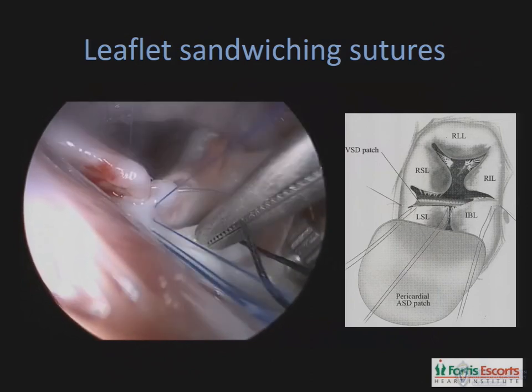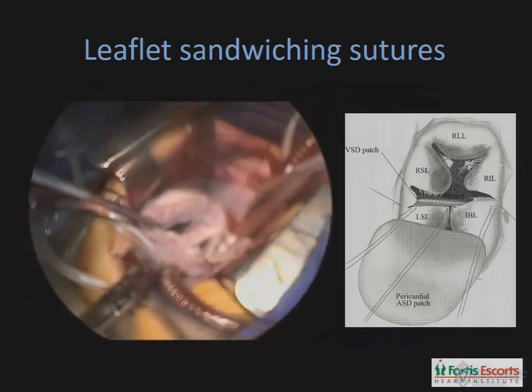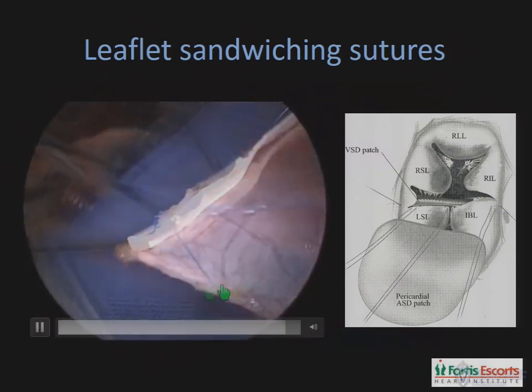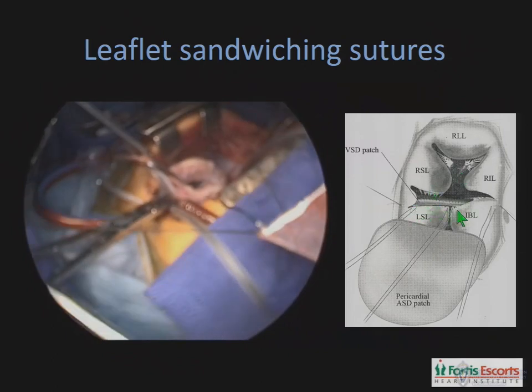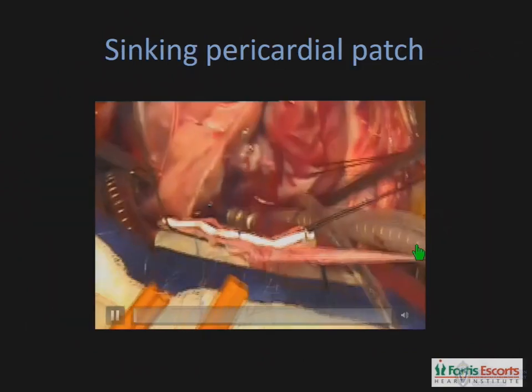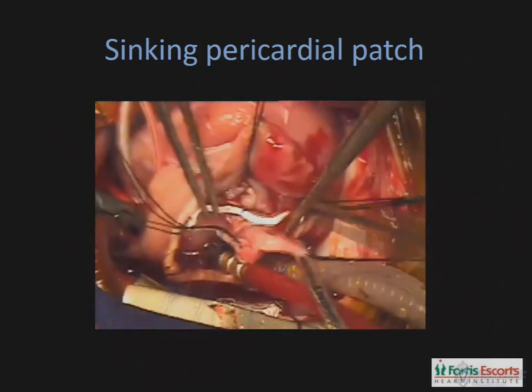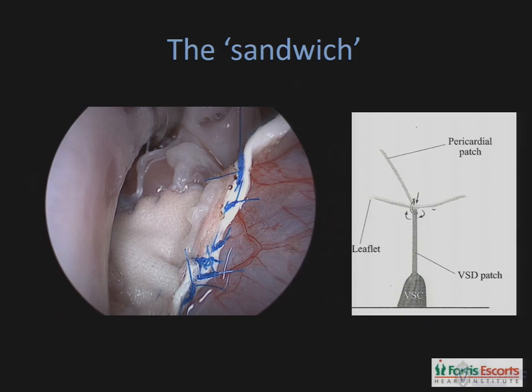Then we move on to the step where we sandwich the bridging leaflets between the two patches. These are interrupted sutures which run along the upper margin of the ventricular septal defect, pass through the bridging leaflet at the line of proposed septation between the tricuspid and the mitral components, and then pass through the pericardial patch which has been buttressed with the Gore-Tex strip. Once we place these sutures, we sink that pericardial patch down and tie the sutures. At the end, once all the sutures are tied, we achieve this partitioning between the mitral and tricuspid components — you can see the leaflet sandwiched between the pericardial patch and the ventricular septal defect patch.